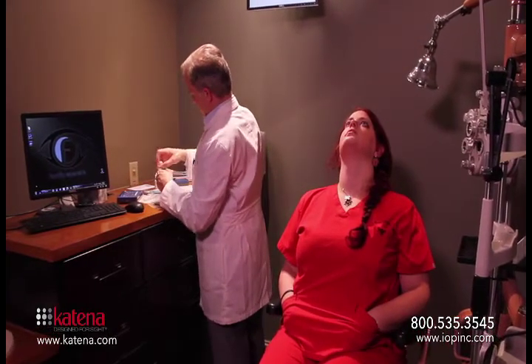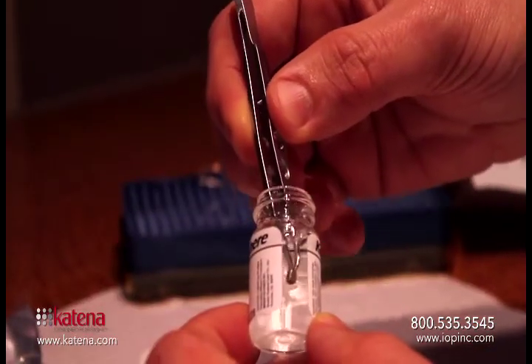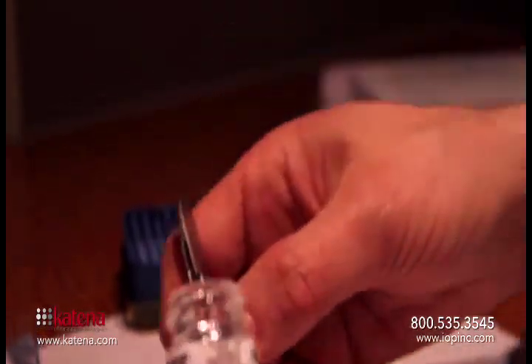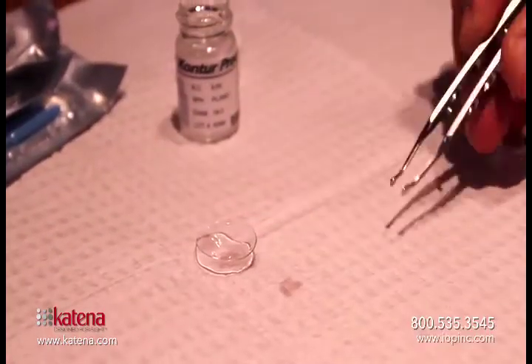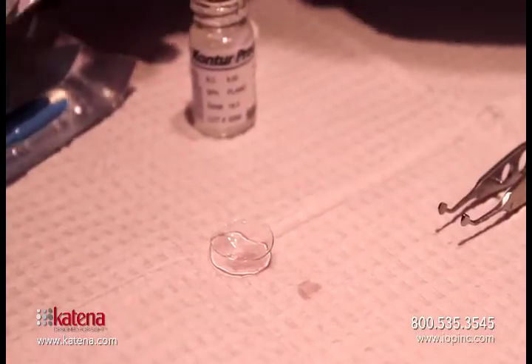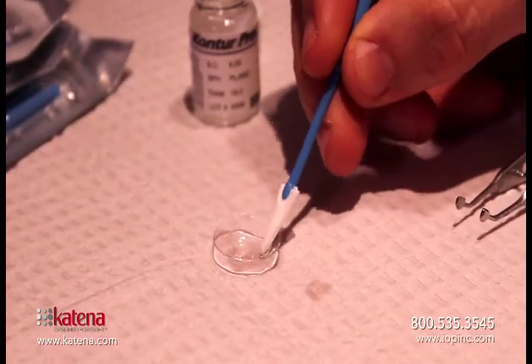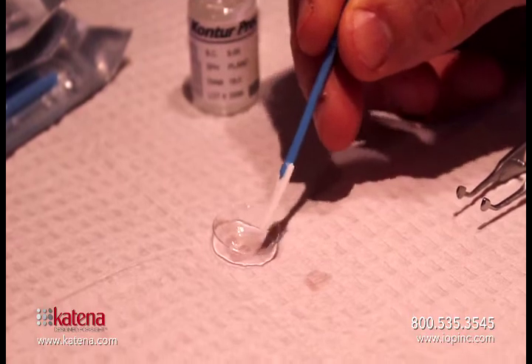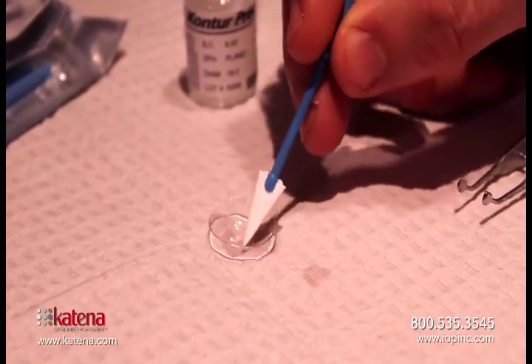Next you'll want to prepare the contact lens. I find the non-toothed forceps make it easy to get the contact lens out of the vial. I like to place it on a sterile pad and then I'll use a dry Wex cell to dry out the back surface of the contact lens. We want the back surface of the contact lens to be as dry as possible so that the AmbioDisc tissue will stick to the back surface nice and secure.